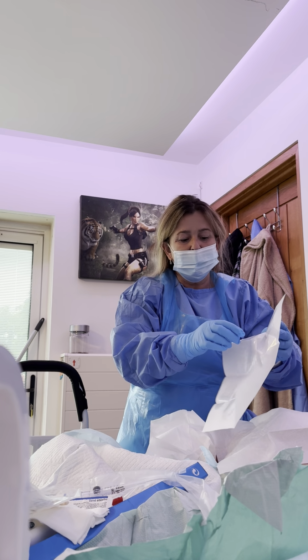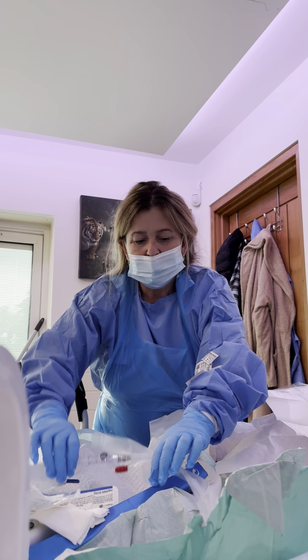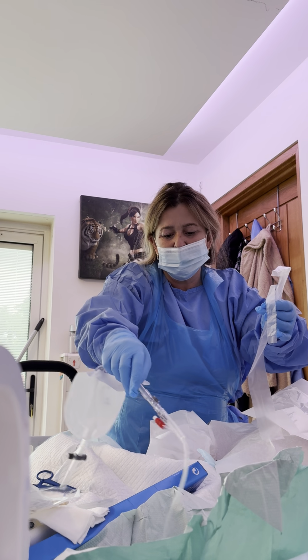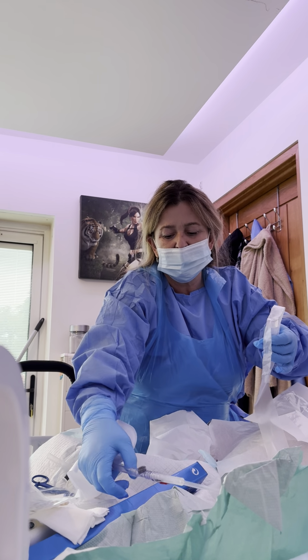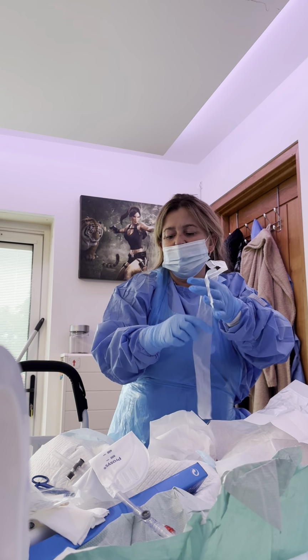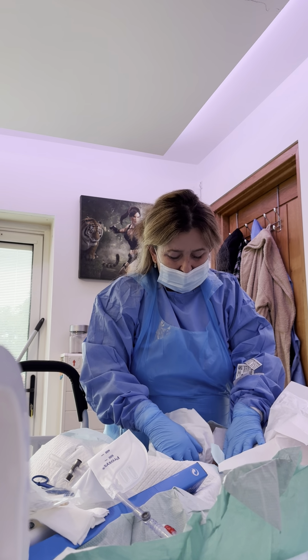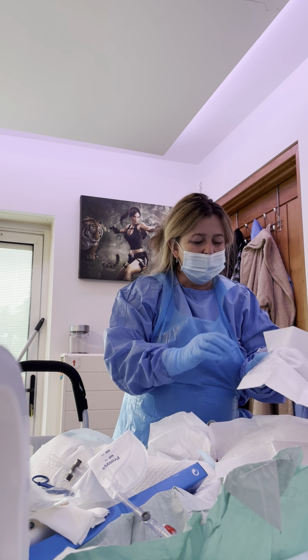So I'm going to grab this. Before I put this on, I've checked the balloon. I haven't had time to show you the balloon, unfortunately. So that'll go into the instillagel there. It goes in by about 2.5 centimetres. I may put it in a little bit deeper, and then I might put in 11 mils to keep it in situ, just because I don't want it falling out, and I don't want the faults going on like this.